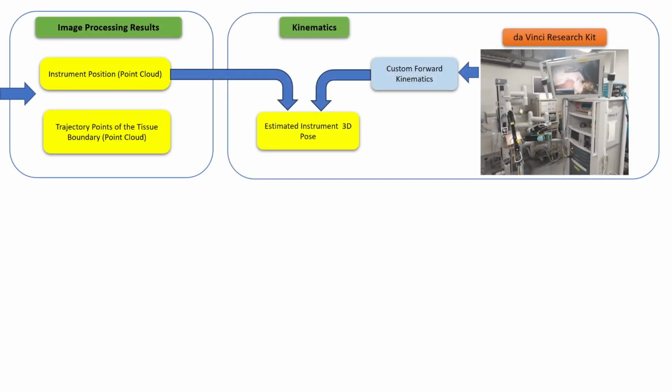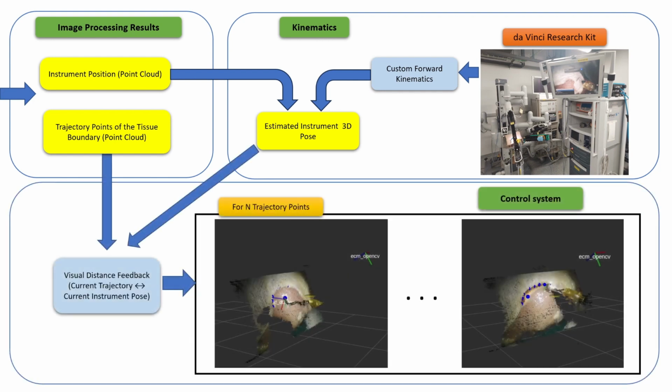Additionally, we introduced our own calibration method for the Da Vinci system using fiducial markers. Combined with Detectron2's keypoint detection, this allows us to accurately estimate the instrument's pose. The robot now receives visual feedback based on the distance between the instrument and its current trajectory point, enabling it to move smoothly along the trajectory while continuously updating its distance.